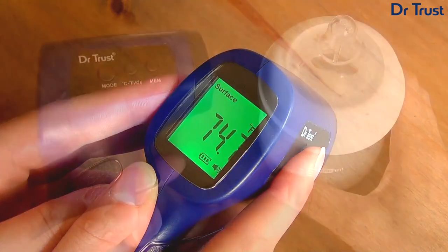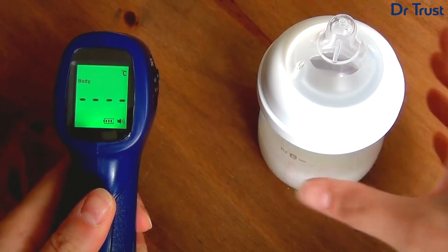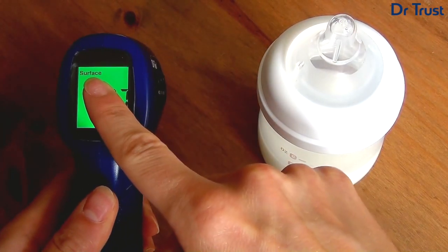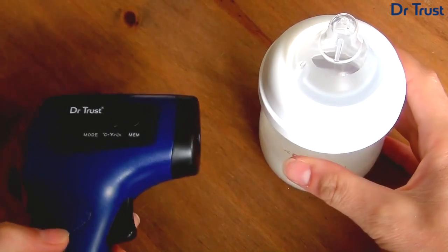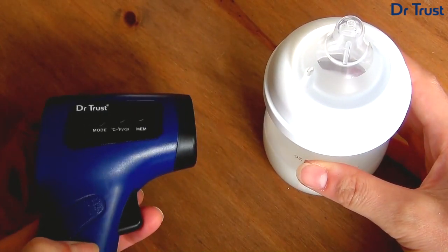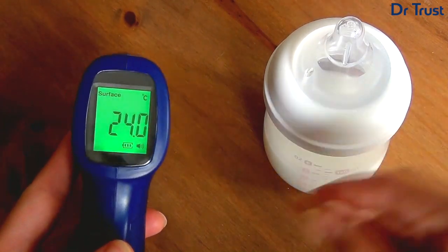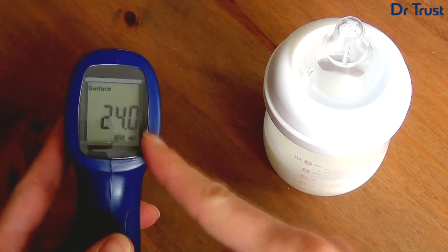To take a surface or object measurement, such as the temperature of food, electronics or baby milk, hold the device 3–5cm from the surface and pull the trigger. The advanced AccuSensor technology will take a precision reading in just one second, which will be displayed clearly on the LCD display.